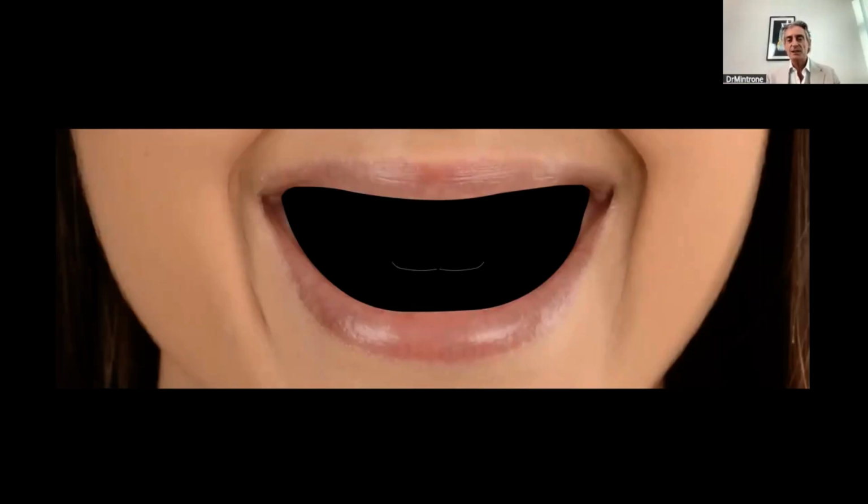And then the first is the location of the incisal edge that we can do with different, I'll say, evaluations. For example, the rest position of the patient. After the evaluation of the ideal position of the incisal edges, we have to find the future gingival margin. So where we want to have the tissue. Doesn't matter if it is there or not.